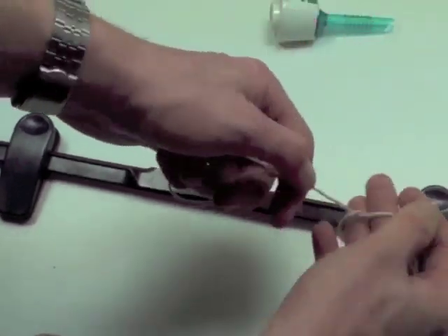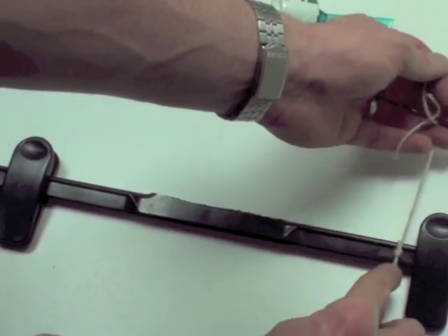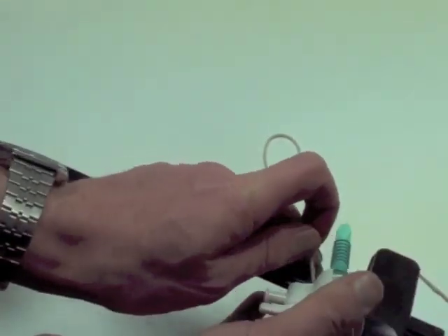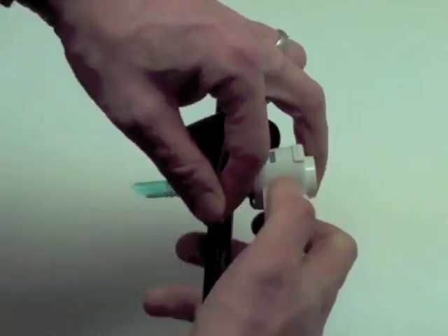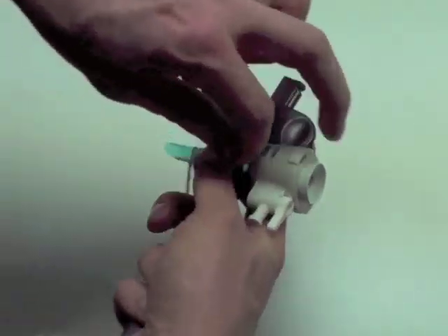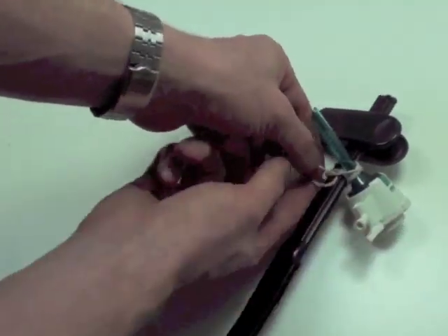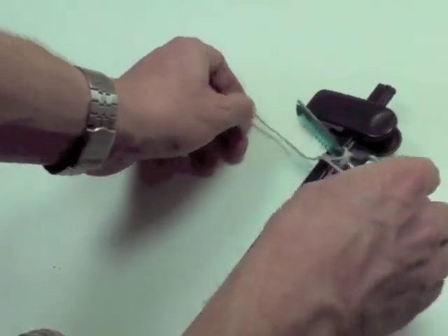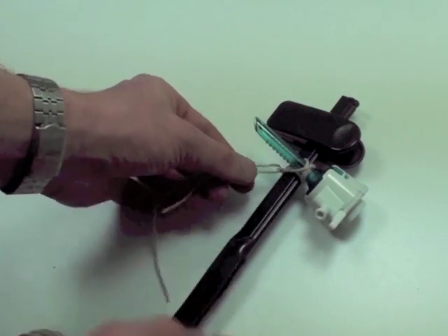The way I found it's easiest to do this is just to tie a knot to anchor it at either end. You don't want it to be too tight because you want to be able to move it left and right. And then just using a figure of eight, lash the trocar onto the skirt hanger, and just tie a knot to fix it. You'll want to do this at both ends so that you have two trocars.